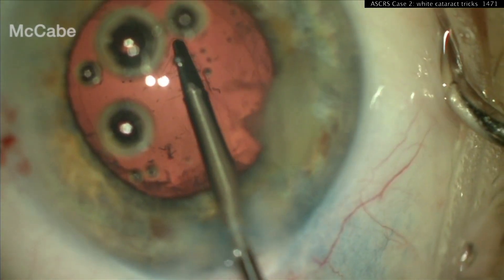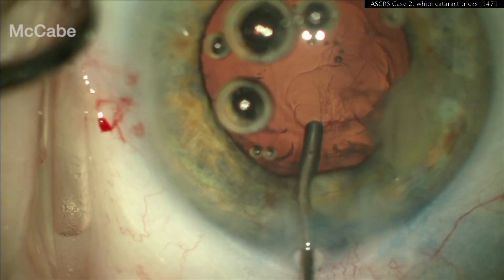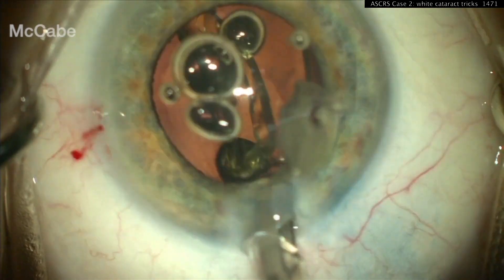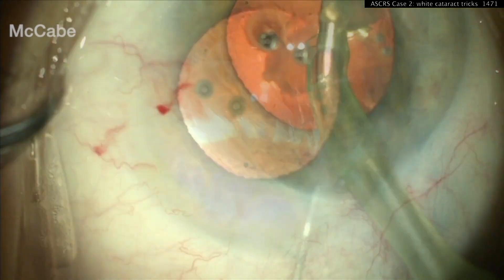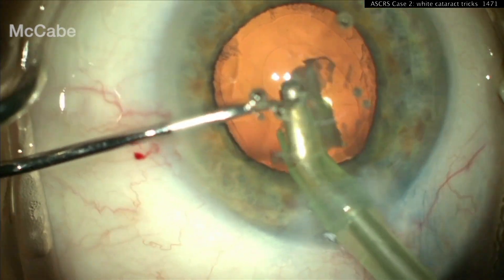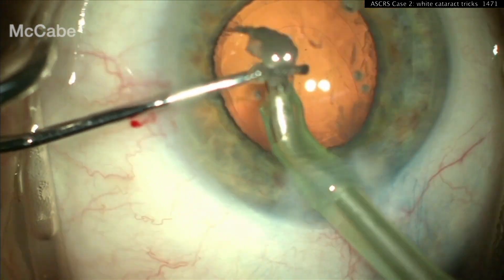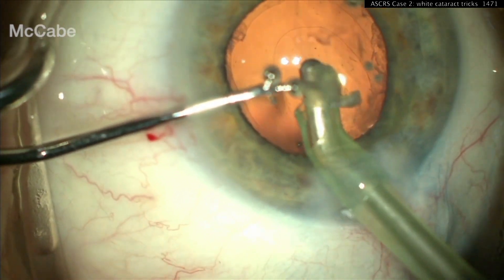It can be any size. It doesn't have to be centered. It doesn't even have to be perfectly round as long as it's continuous. More viscoelastic goes in. The IOL can actually go in the capsular bag — you have a posterior capsulorrhexis, but remember, you also have an intact anterior hyaloid face. Now you can just take out that last lens material — in this case using the IA probe with a second instrument to push it down. And at the end of the case, you've got a really nice-looking outcome.